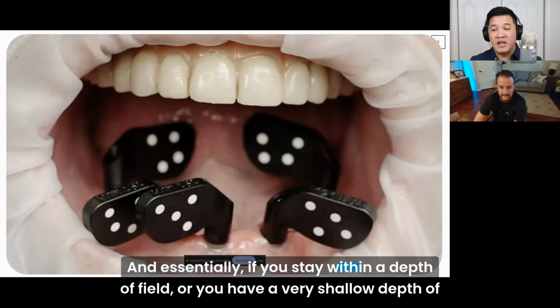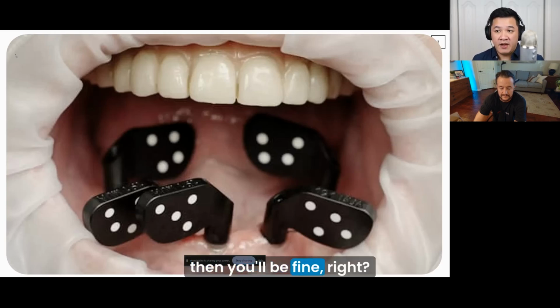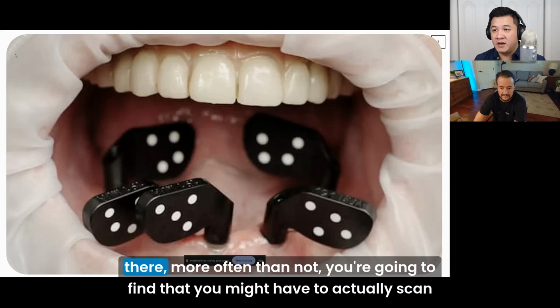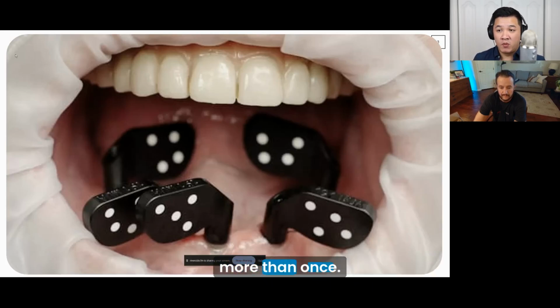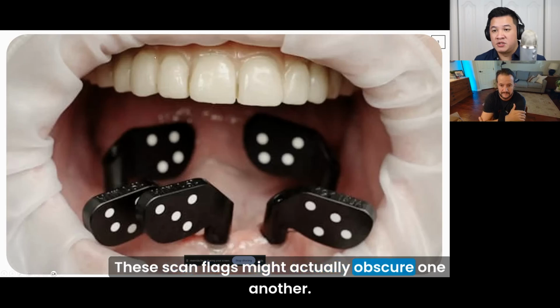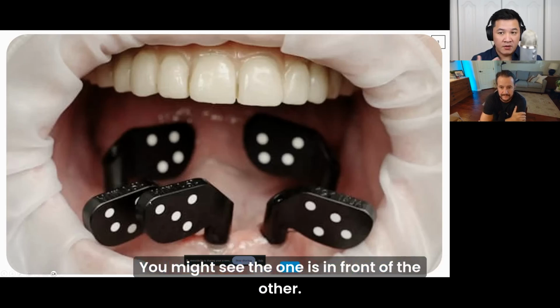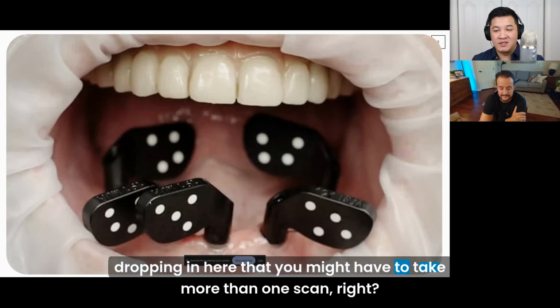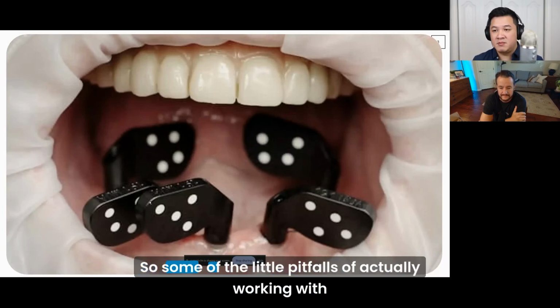Essentially, if you stay within a depth of field, or you have a very shallow depth of field, then you'll be fine. But if you're doing something like remote anchorage, something with pterygoids, more often than not you might have to scan more than once. These scan flags might obscure one another. You might see one in front of the other, so you'll have to take some scan flags out. Just a little pearl I'm dropping in here: you might have to take more than one scan. Those are some of the little pitfalls of working with photogrammetry.